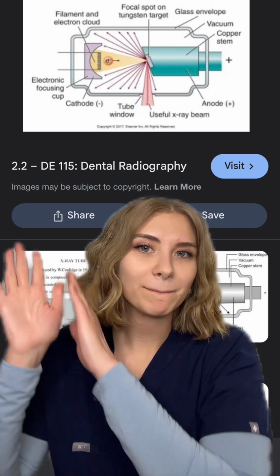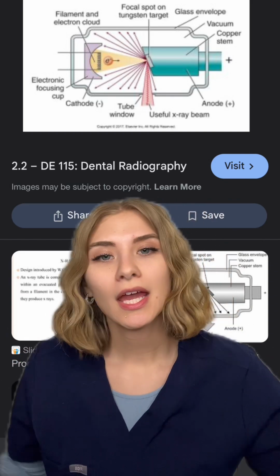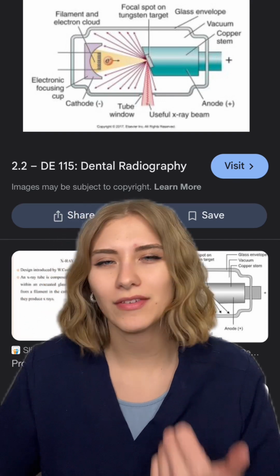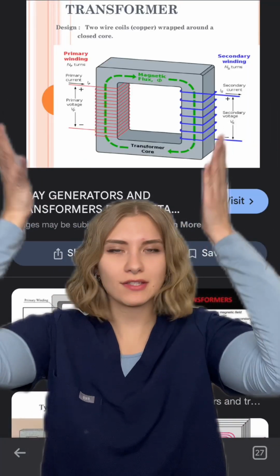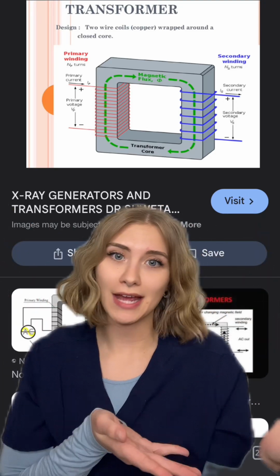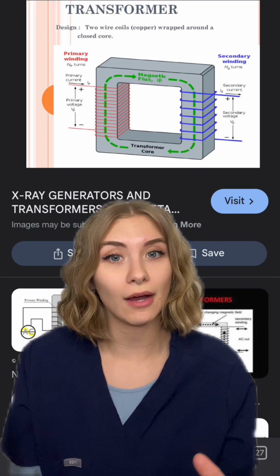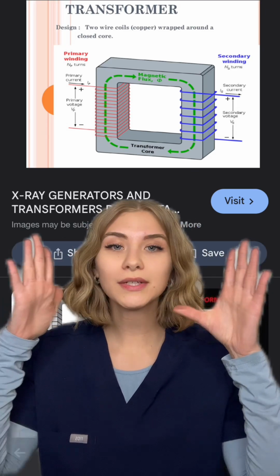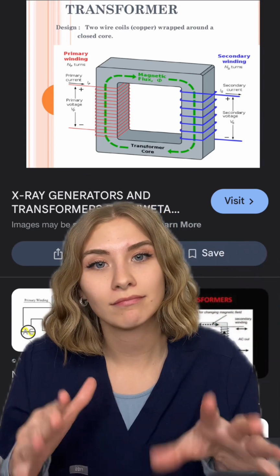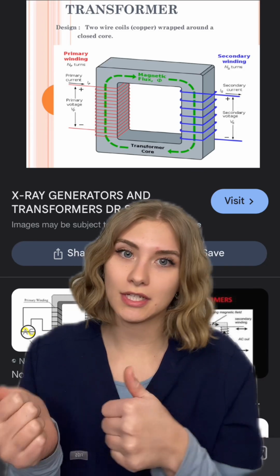So in the power unit and power cord and everything, there are also these important things called transformers. And no, not Transformers, the movie kind of thing, the robots. We have these other things. So this is the transformer. I didn't learn too much about this other than there's a step up and step down. The step down transformer basically heats up the tungsten filament to create the electron cloud. The step up transformer increases the voltage to propel towards the tungsten target. So step down does the tungsten filament, and step up goes to the tungsten target.